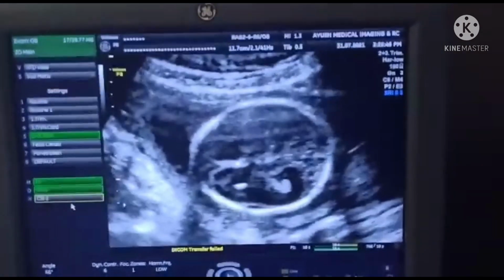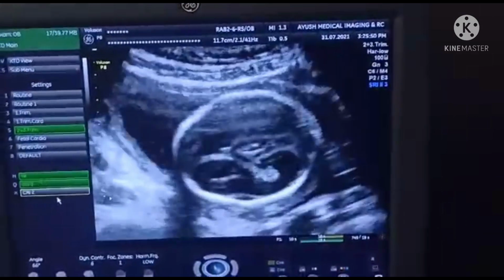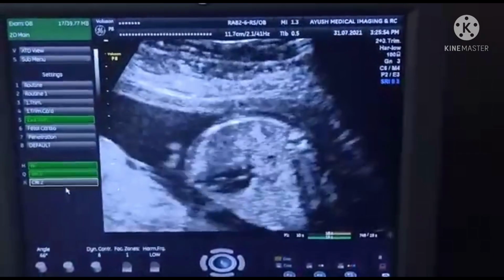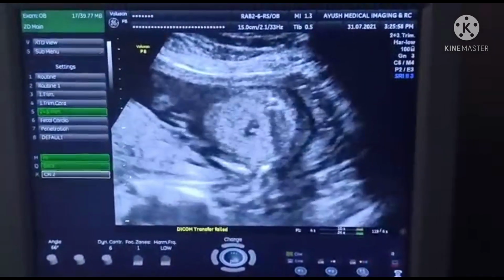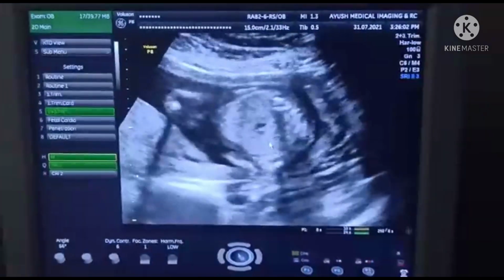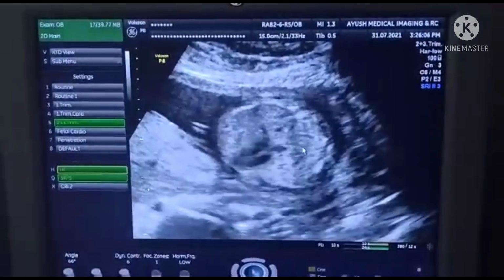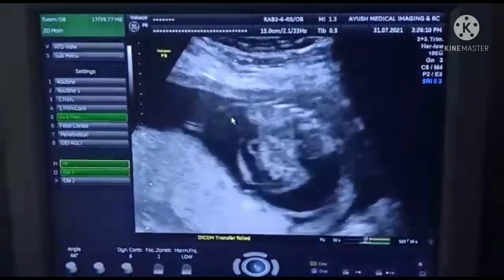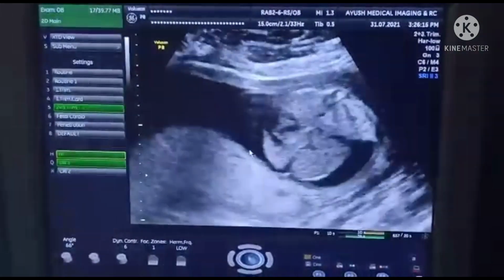This is a second trimester anomaly scan, and this is the fetal head. As we go lower down into the thorax, we start appreciating that the lungs appear brighter than usual. These are hyperechoic lungs, and when we look at the cardia here, the cardia is compressed by these hyperechoic lungs, and as we go towards the abdomen, we see that there is a gross fetal ascites.